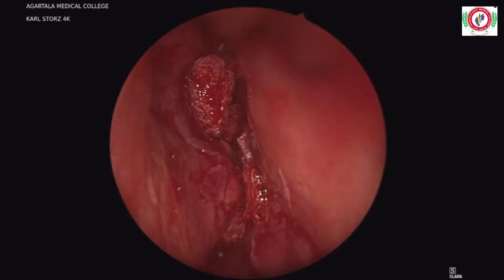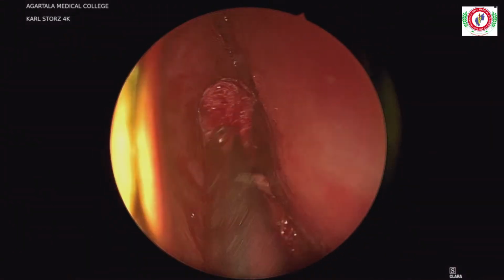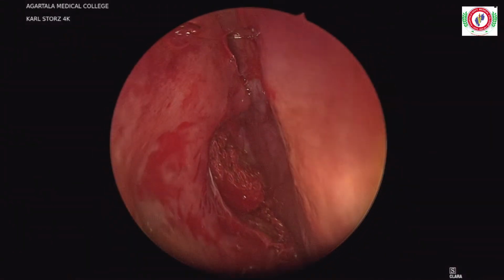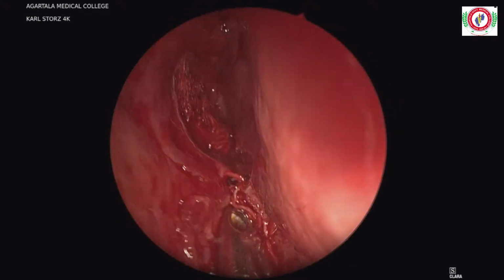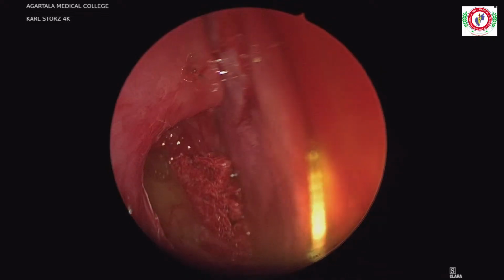See, so we have got a very good exposure now. So once the BP is controlled, I'll start again. Okay, give me pack.